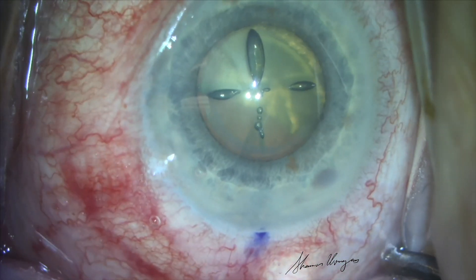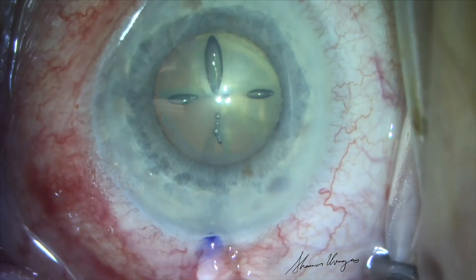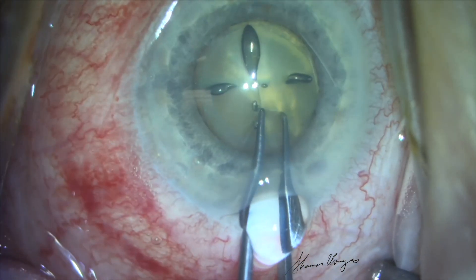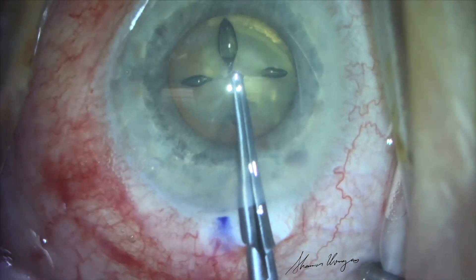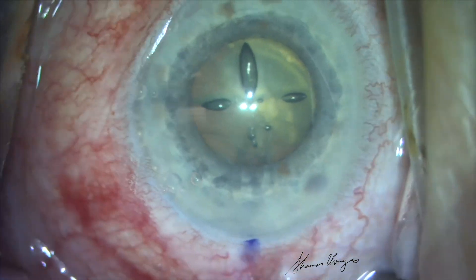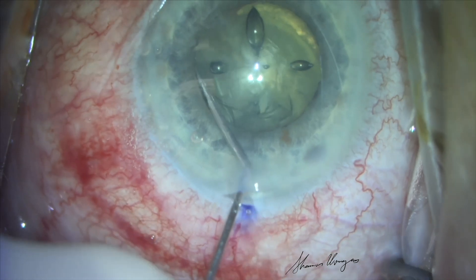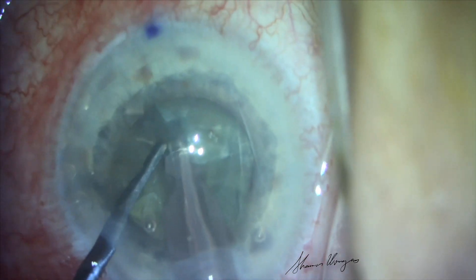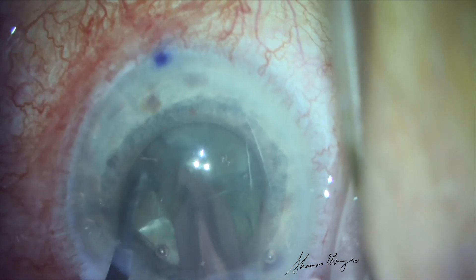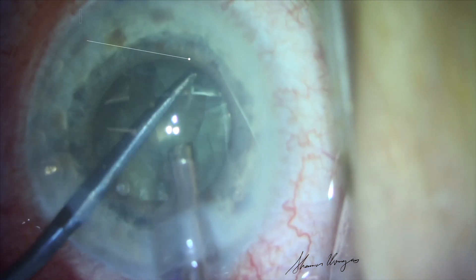This patient is an 85-year-old with dense cataracts in both eyes. We're planning to remove his left cataract and place a panoptics lens into the left eye. At the beginning of the video, we've already completed the capsulorhexis and a partial nuclear fragmentation with the LensX femtosecond laser. This patient also had a tendency to move a lot during his procedure. The pupil is dilated to about 5 millimeters.